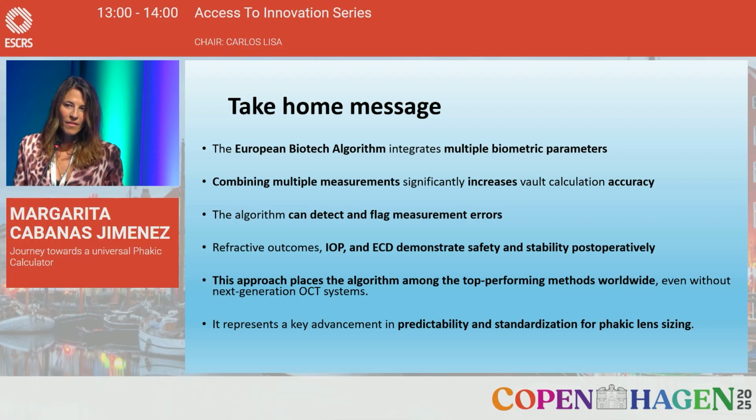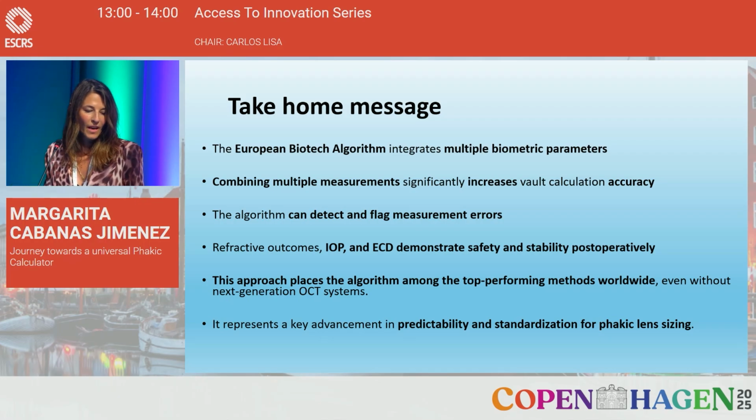So, in summary, to take home messages, I can say that the European Biotech algorithm integrates multiple biometric parameters. Combining multiple measures significantly increases vault calculation accuracy. The algorithm can detect and flag measurement errors.